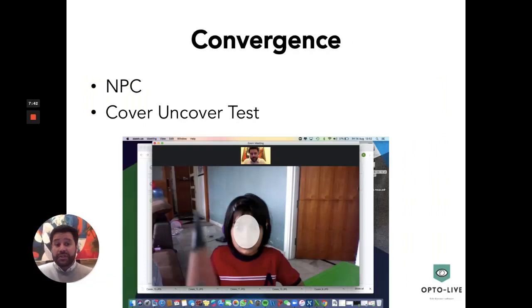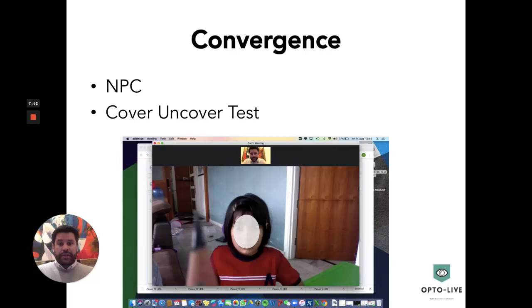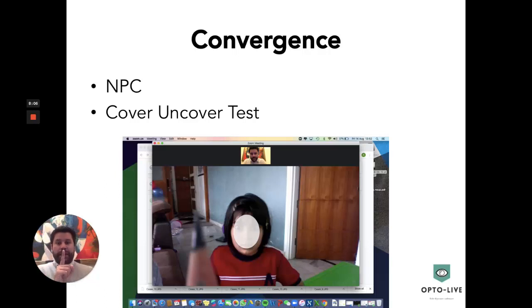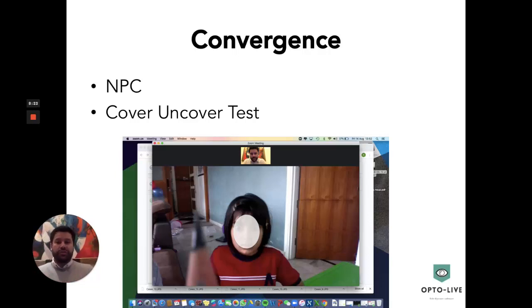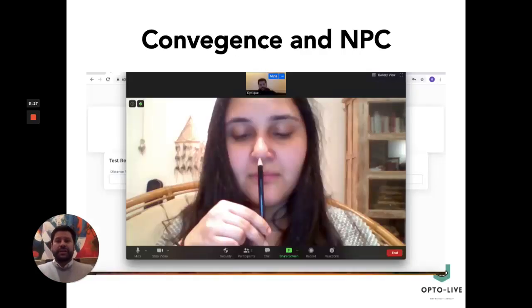Another test — which doesn't require Optolive and can be done over a standard video calling platform — is convergence. We ask the patient, child or adult, to place a pencil between the camera and themselves and bring it closer while we observe the eyes. Once the patient reports the pencil appearing double, we ask them to place as many fingers as they can between the pencil and their nose, then measure that distance on a ruler to assess how far the near point of convergence was from the nose.